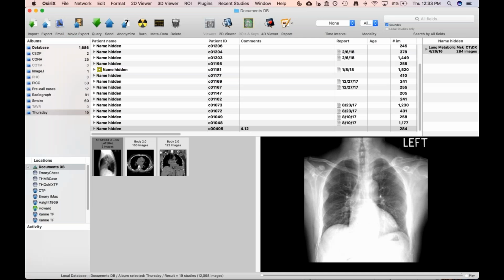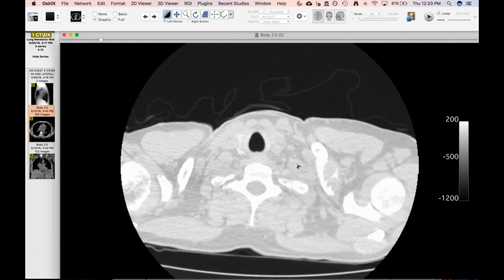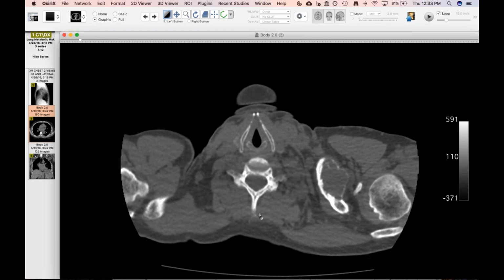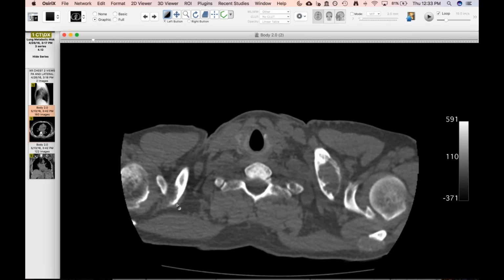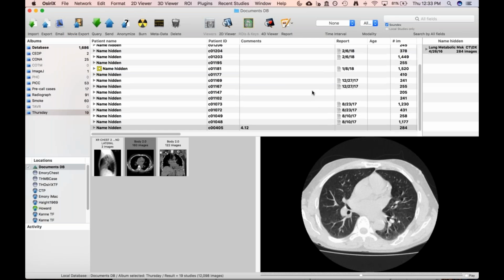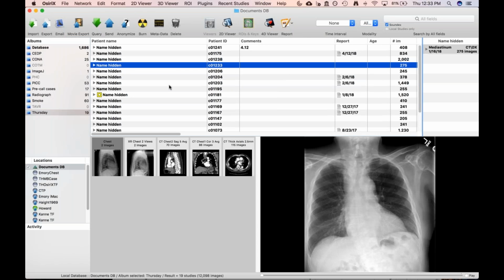And that's a good question. And then it's a big expansile thing. Yeah, but you're right. It is in the region on the left. I don't know. Or if it's just the same thing that was much more exuberant on the left. I don't know. But like I said, I waited long enough for path, but I was following up, and he's been transplanted. So that's what they think the diagnosis is too.